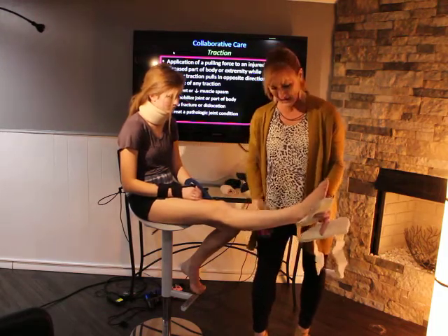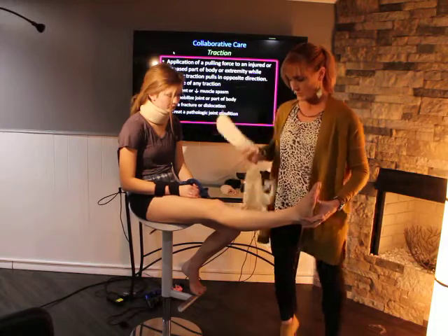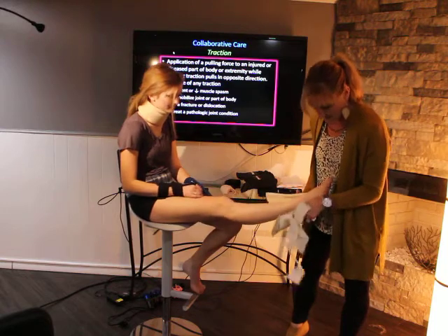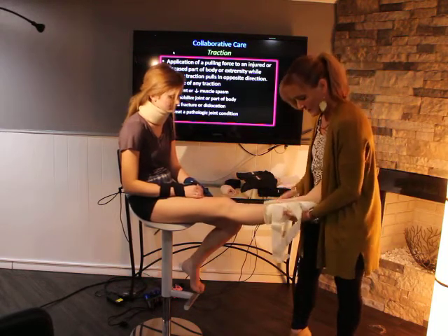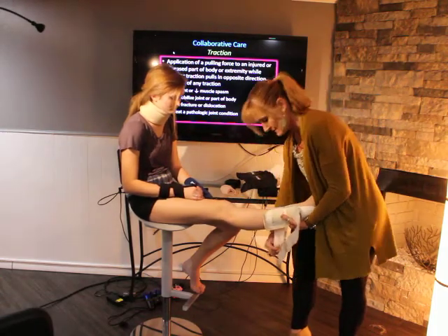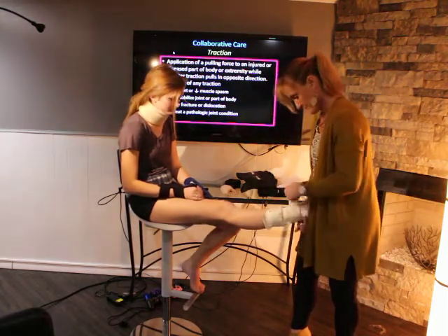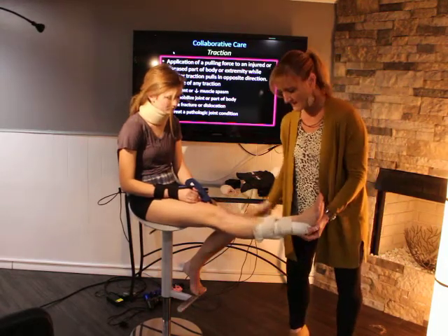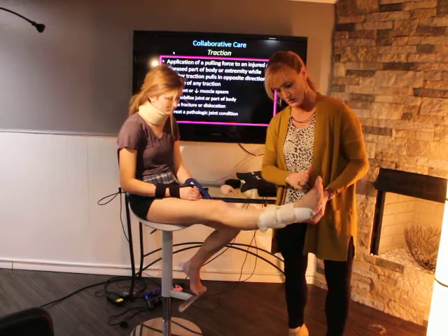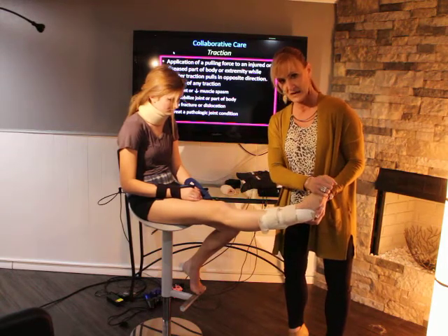So oftentimes what they'll do in patients that have this kind of injury is they will start out with something like a splint. And what you're going to do on a splint is you're going to put it on either side of the injured joint like this. You're going to clamp it around, and this is kind of going to mimic a cast. Again, you're going to use these little Velcro straps, wrap it around like so, like that. And now I have immobilized this bone, but there's enough expansion here so if this joint is continuing to swell, it's not going to cause compartment syndrome down in her toes.